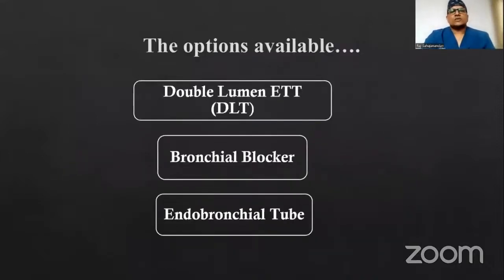The options available to us are the double lumen tube, which is still the gold standard, the different bronchial blockers, and the endobronchial tube or a single lumen tube, which are specialized tubes that were available earlier and now.